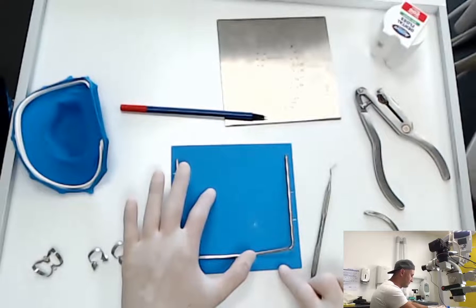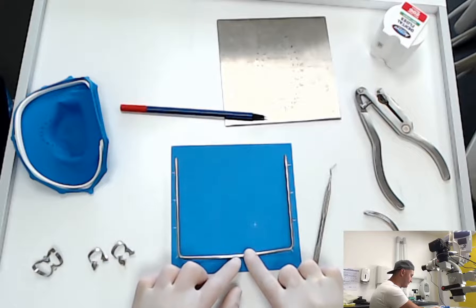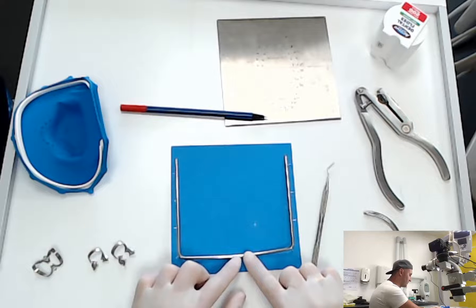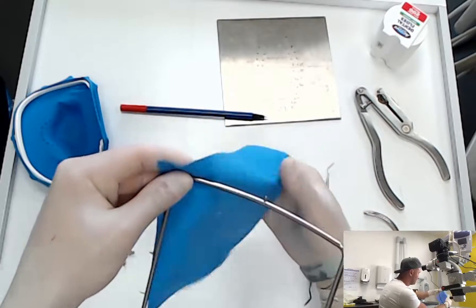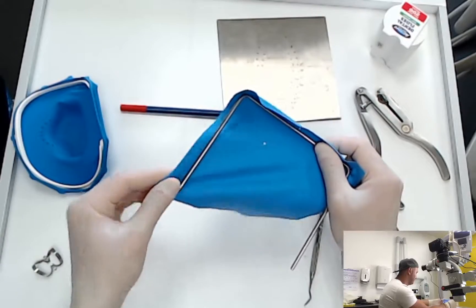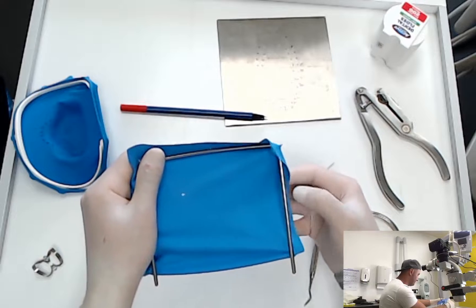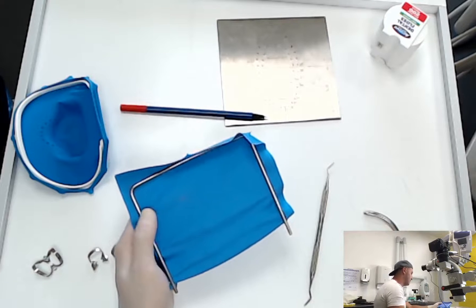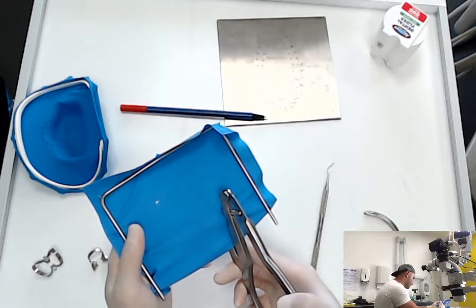If this is the position of tooth number sixteen, you place your frame like this so the lower part of the frame is farther from tooth sixteen — that part goes under the patient's lower jaw. Now you put your rubber on your frame, not too tight, just enough to make it hold.